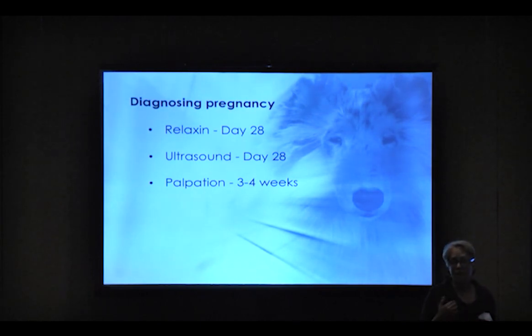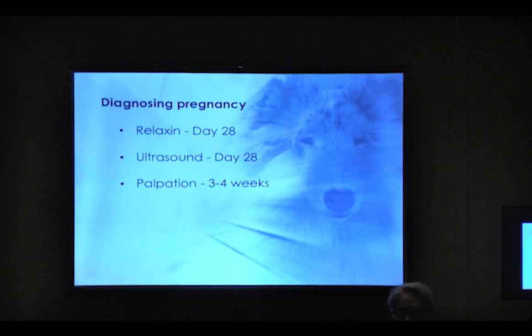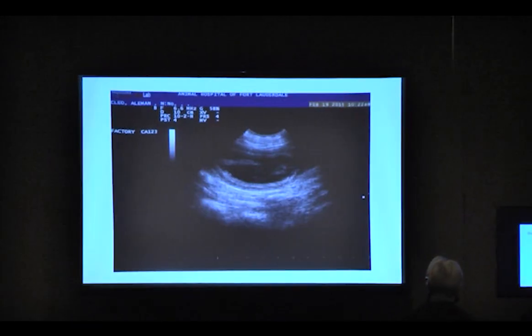Diagnosing pregnancy. My favorite way of diagnosing pregnancy is by ultrasound. I can do it as early as day 19, and I'll show you a day 19, but I usually like to do them a little bit later so I can get a good heartbeat. So I usually do them about day 24 to 28, after the LH surge. Palpation, I can do about 3 to 4 weeks. At 3 weeks, they feel like little tiny quarter-sized pieces inside the abdomen. But after 4 weeks, everything gets so big you can't feel those individual pieces, and it's hard to palpate at that time. You don't know whether she's fat or whether she's got puppies.